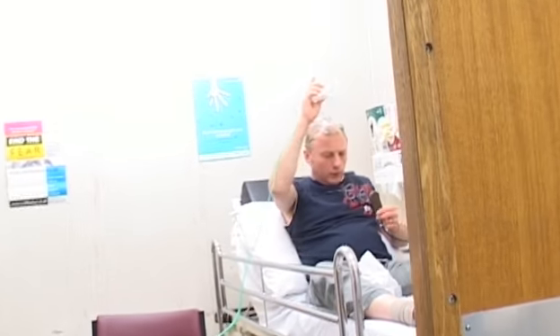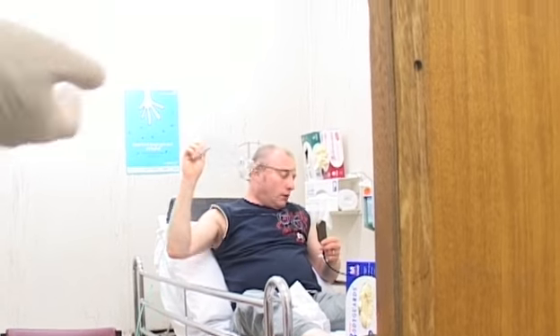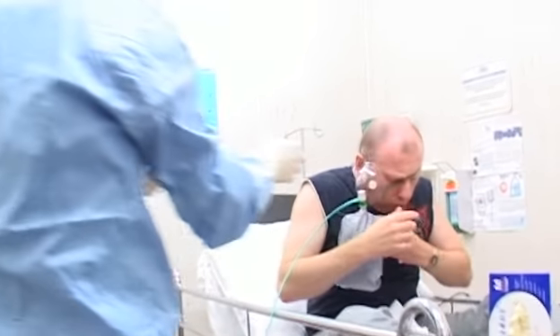Compliance. Some patients will not tolerate oxygen masks well and may complain of a sense of claustrophobia or a dry throat. If the patient is restless or confused, they may need very close supervision and assistance to help them tolerate oxygen therapy. When giving oxygen to children, education of the parents about the need for oxygen is important to give them confidence in the treatment. If the patient is being isolated due to infection control considerations, there may be even less compliance once staff leave the room.